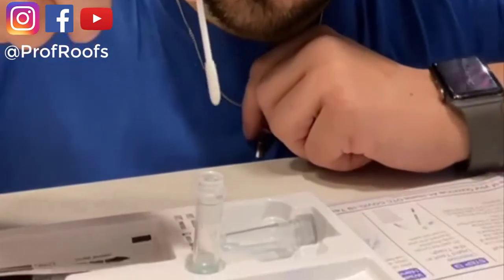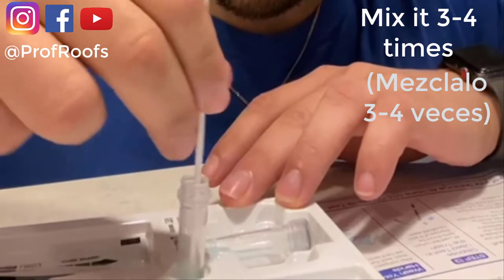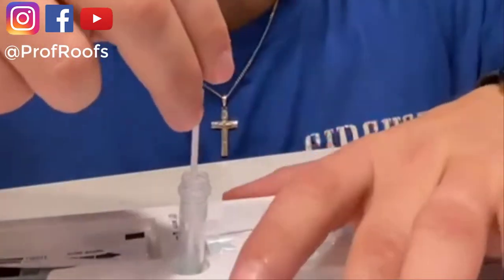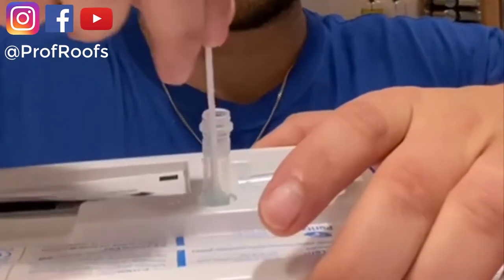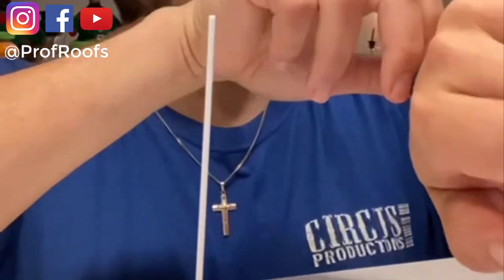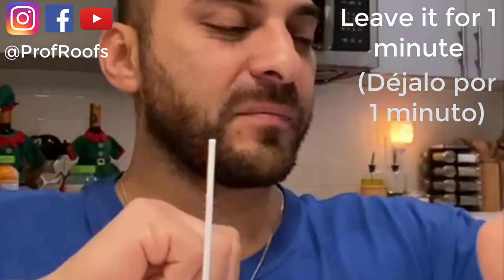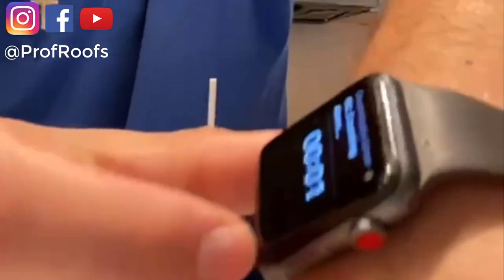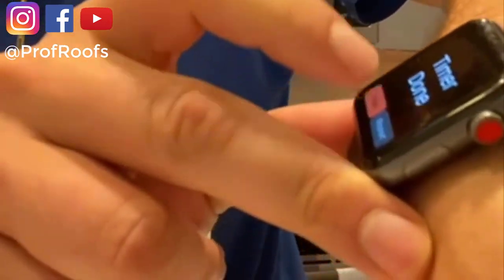Then you're going to put it in for 1 minute. Lo vas a meter por 1 minuto. Y lo mezclas como así, como tres, cuatro veces. Okay. Así. Okay. And temporizador timer, 1 minute. 1 minute timer. Come on, Siri. Okay. Yeah. One minute and counting. 1 minute. Lo vas a dejar por 1 minuto. Okay. 2, 1. Timer done. All right. Stop.